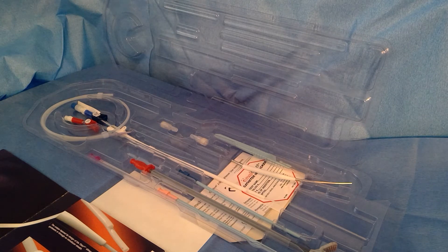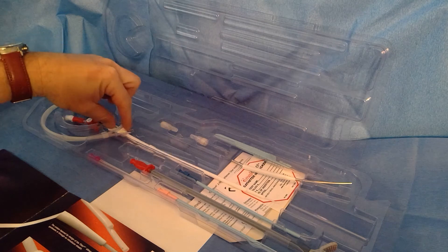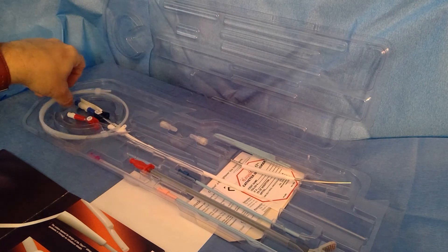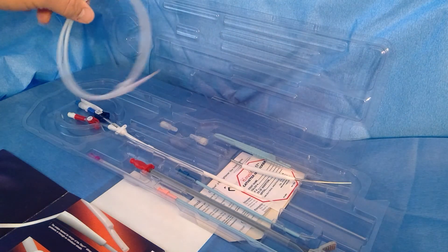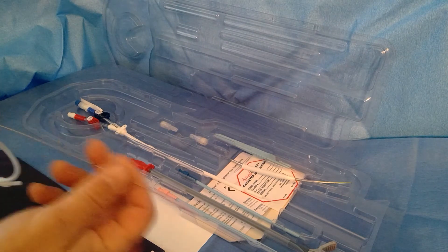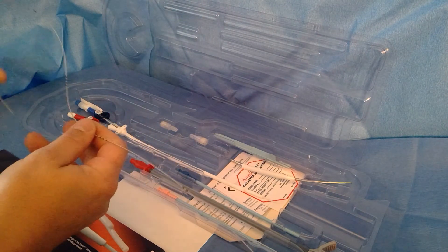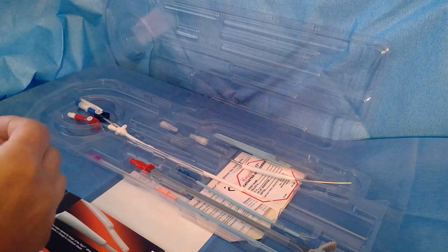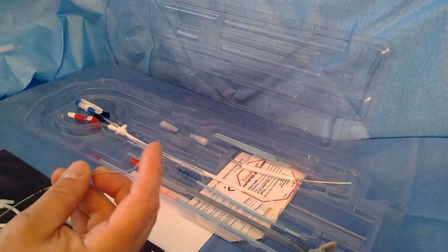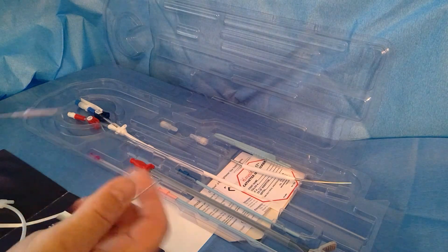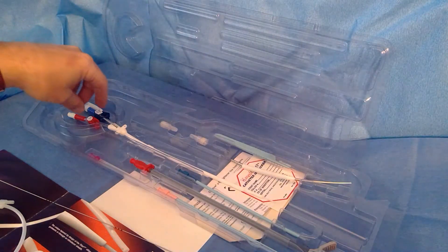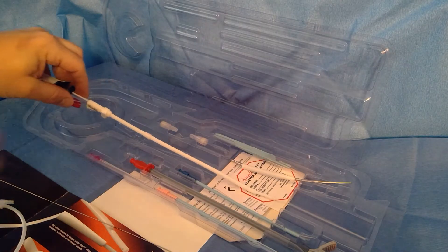This particular catheter is the Titan HD. It comes with things you're probably familiar with. You have a 0.038 J wire here with markers on it if you use those. A lot of people don't, but if you need them they're there. It's also unique in that it has an LLT tip if you like that, or a J tip on the other end if you use that. Most people I guess go with the J tip, but if you need to, you have the LLT on the other side.